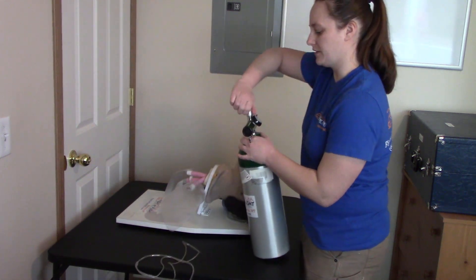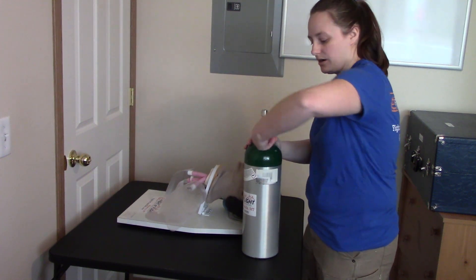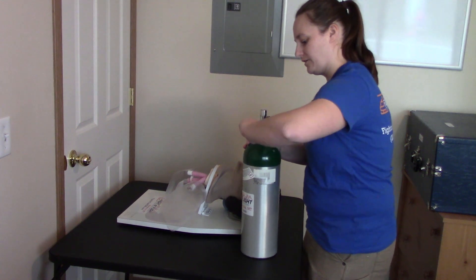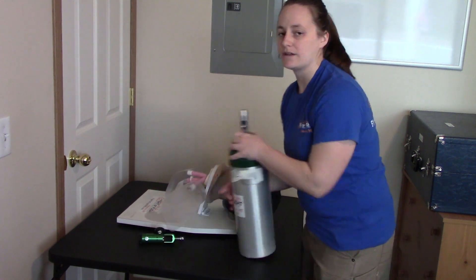I will now turn the tank off by turning the knob clockwise. I will now bleed the regulator, turn the regulator off, and remove the regulator from the tank. And that's the whole station.